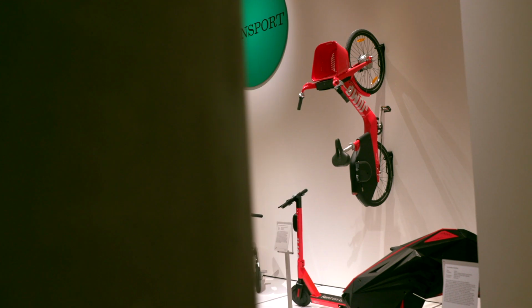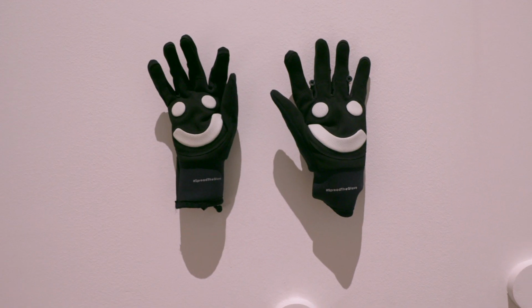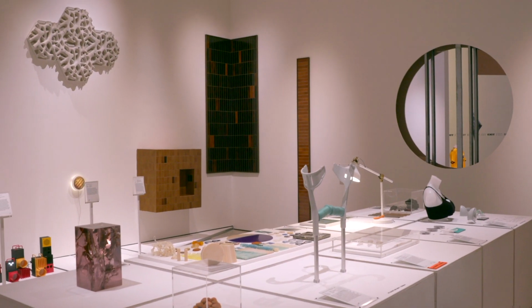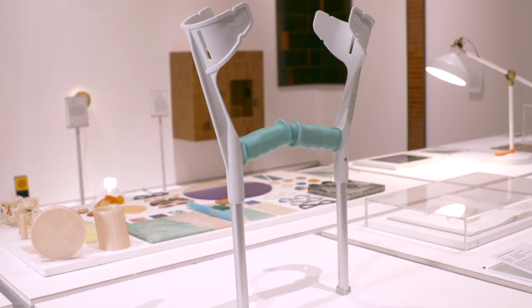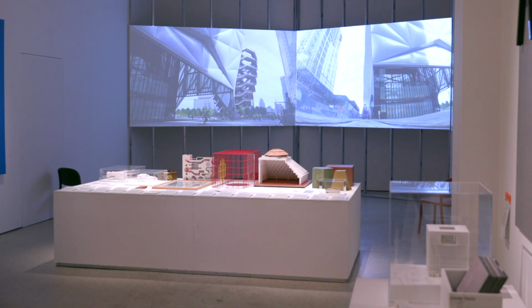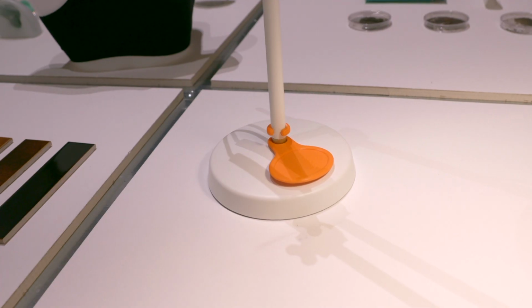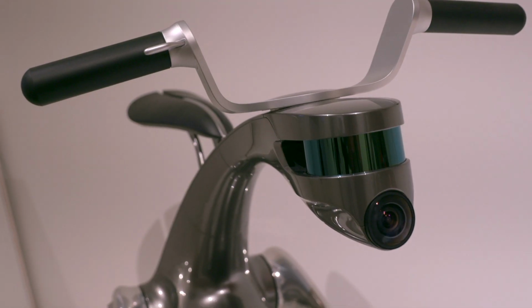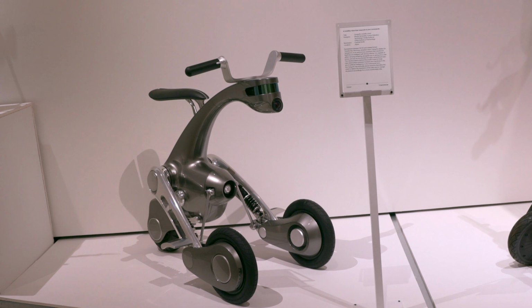This is the Beazley Designs of the Year exhibition at the Design Museum London, which features some great examples of inclusive design. This is MySleeve, silicone grips that make crutches more comfortable. They're also magnetic, so they snap together and can be held in one hand. Disables is a 3D printable add-on that makes small buttons bigger and more accessible. And the Kangaroo is a concept mobility robot, which can carry your shopping for you.